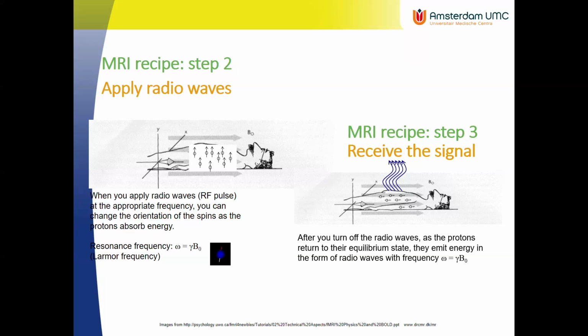Yeah, it's kind of difficult to explain exactly because it's a quantum mechanics effect. So what we basically use here is a whole bunch of protons and describe how they behave. And they behave as if there is like 1 in 10 to the fifth of the protons that responds to the energy. But in reality, they do different kinds of things.